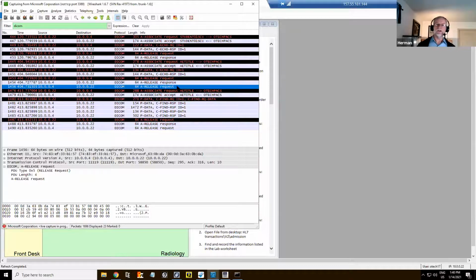So one of the things that you sometimes see, I call it the bonus. At the end of the whole cycle, as long as you've established the communication, done your job and a nice release, if at the end somebody says, okay, I just want to make sure, and does another release or another abort, there's nothing wrong with that. The implementer just wanted to make sure everything is disconnected. So you might sometimes see a bonus command at the end, but you shouldn't be worried about it. Of course, if it's in the protocol sequence, then we should worry about it. Okay, so that was the verification from my workstation.